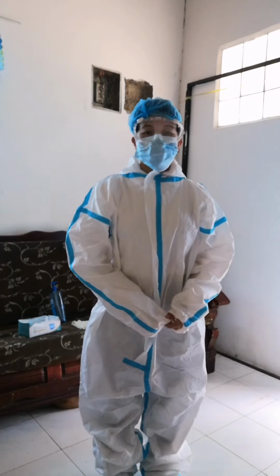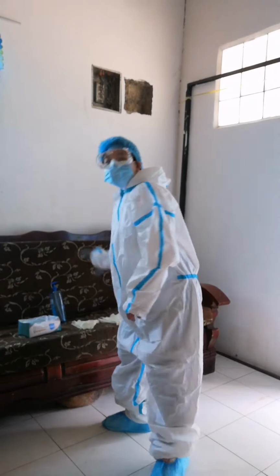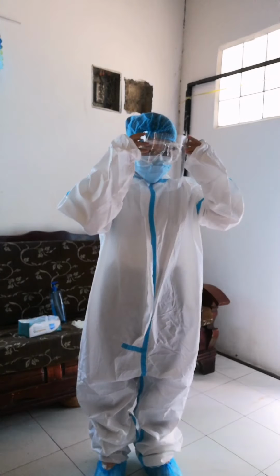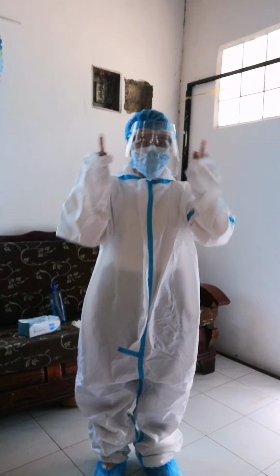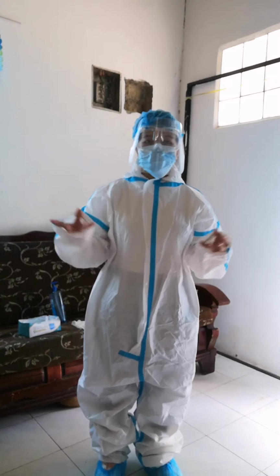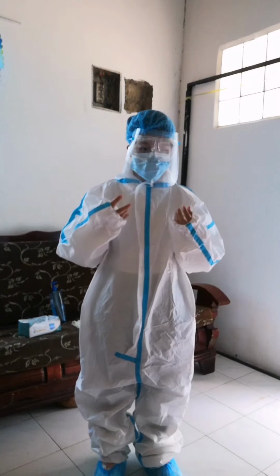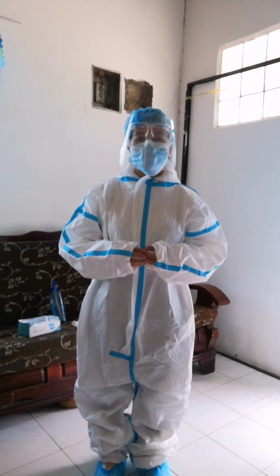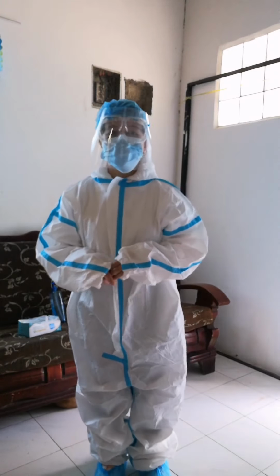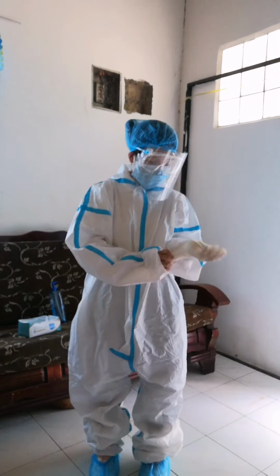So next is to don our face shield. This is also to protect our eyes and the entire face. We must place it over the face and adjust its fit. This is to avoid direct touching of the face and to protect it, especially from coughs. So this serves as our barrier from the coughs of the patient.